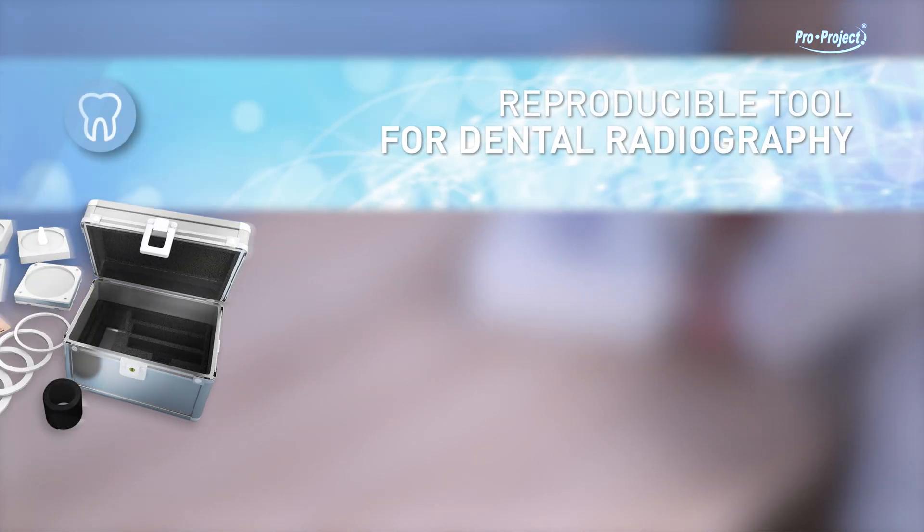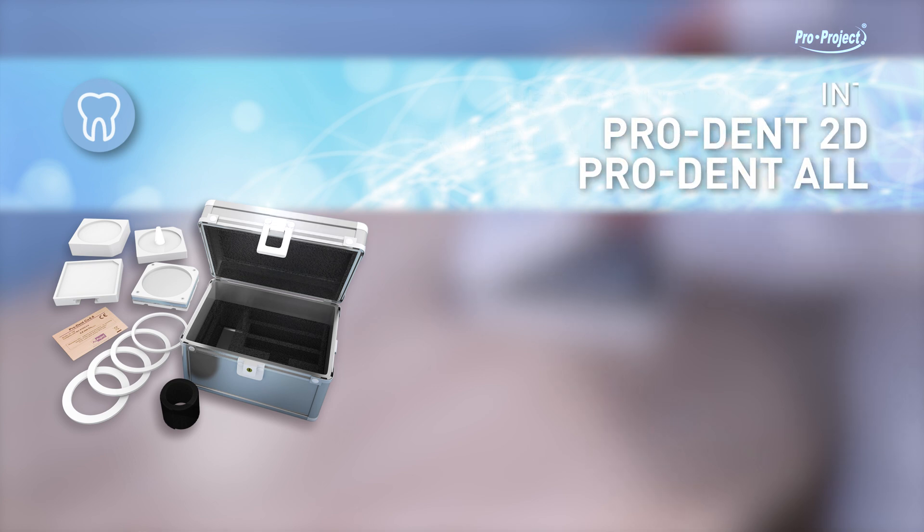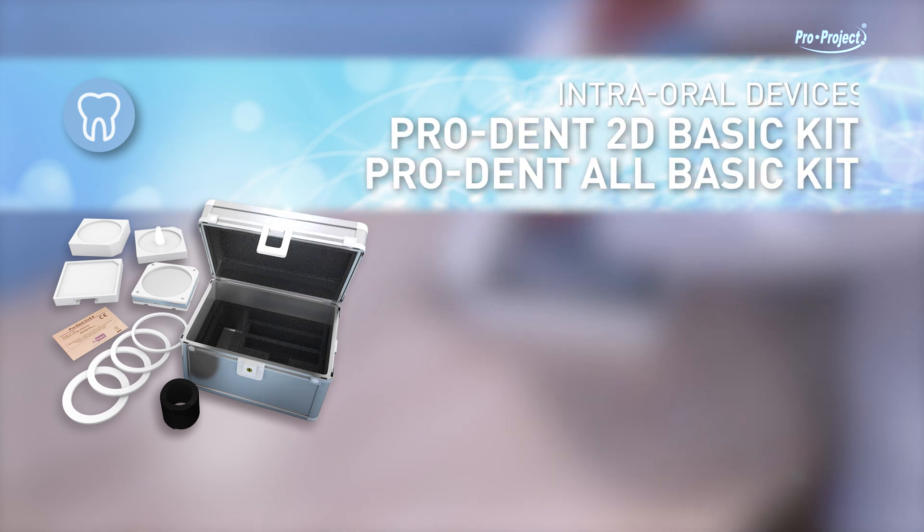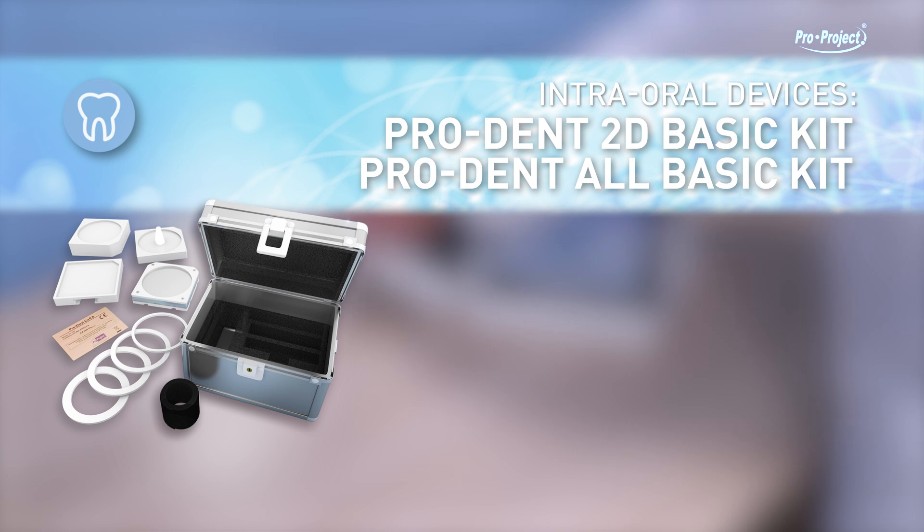Reproducible tool for dental radiography intraoral devices. ProDent 2D Basic Kit, ProDent All Basic Kit. Reproducible tool, reproducible setting, reproducible parameters.